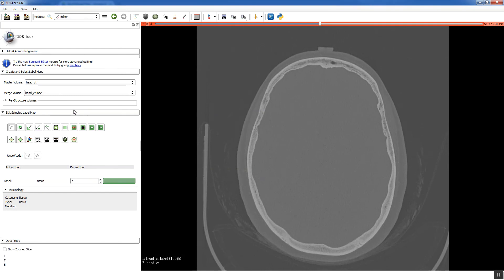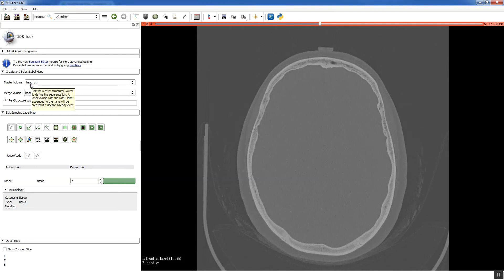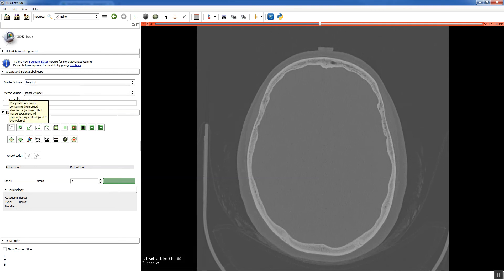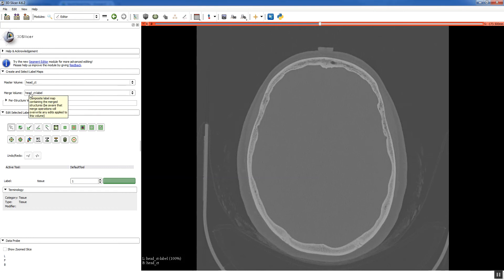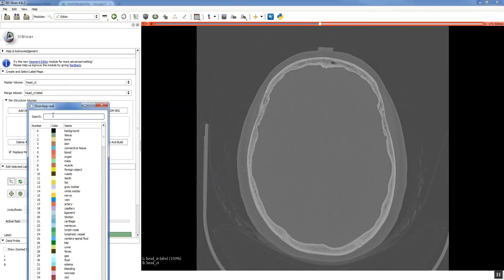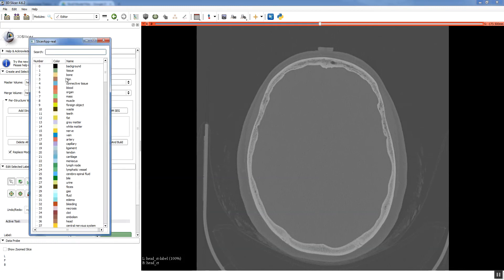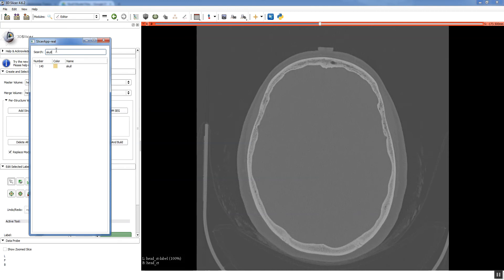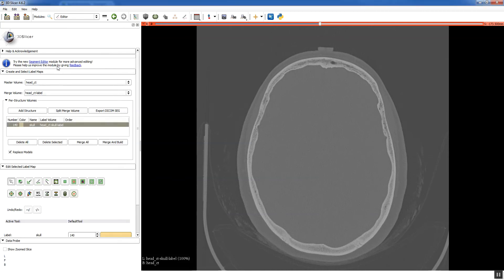Alright, so let's take a second to just look at all the options available through the segmentation module. Here it lists the master volume which is your CT. And that was the name of the file, head_CT. It by default creates a merge volume called the head CT-label. We want to create a skull structure. So I'm going to click add structure. You have to pick from some default names. So if we type in skull, we see that's available. And now we have a skull label.